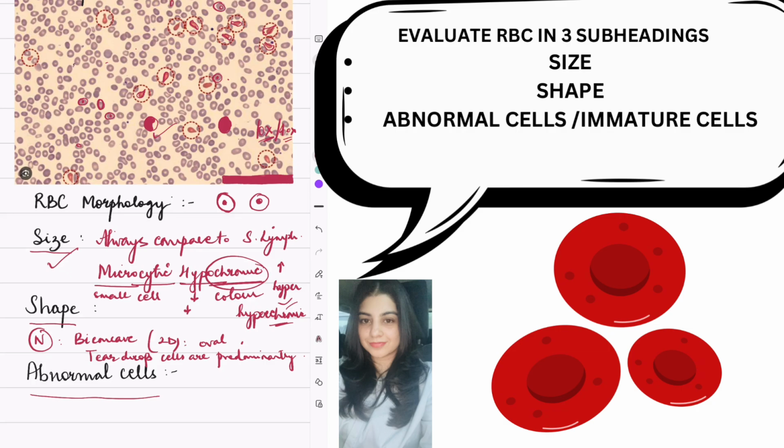Now shape, as you can see, there are teardrops and there is a variation in size. Not every RBC looks alike, so obviously there is a difference in shape as well. So you can say that there is a moderate degree of anisopoikilocytosis. What is aniso?